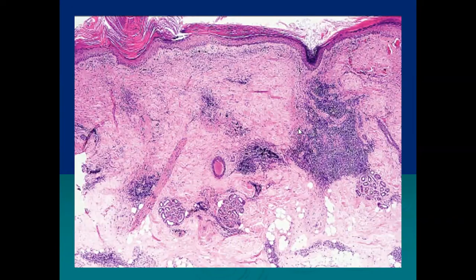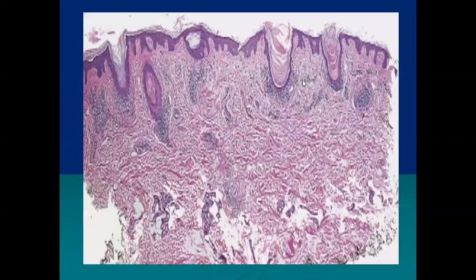This is the feature of discoid lupus erythematosus. You can see here that there is epidermal thinning. There is pigmentary incontinence. There is no band-like infiltrate, but the infiltrate is periadnexal. And there is follicular plugging as well, but not as typical as we see in lichen planopilaris.